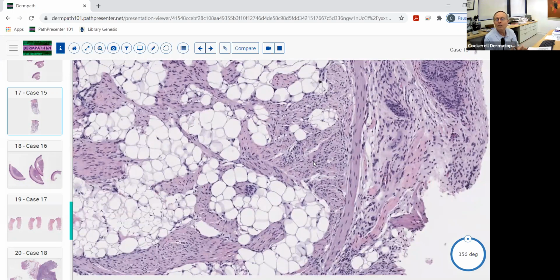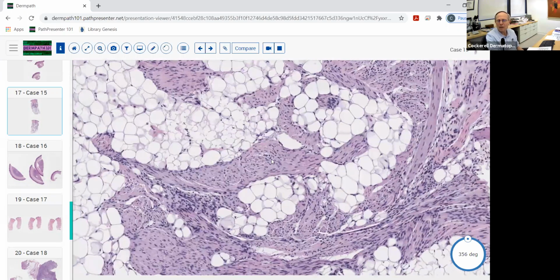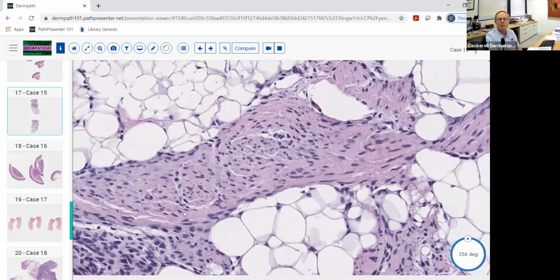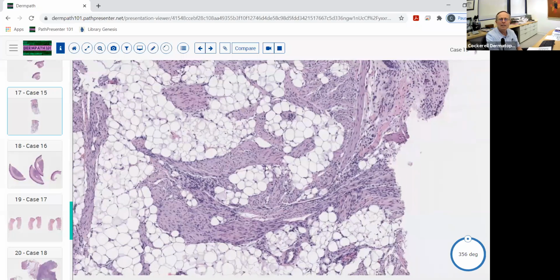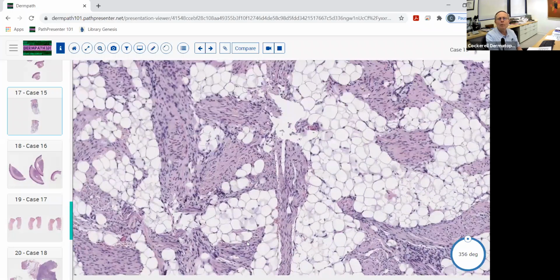fibrous hamartoma of infancy. These little almost whorls of little fibroblasts. They often have a slightly mucinous stroma to them in my experience. It can give you this eosinophilic collagen as well. Sometimes though you get a little basophilia like you see here with a little bit of mucin, and there may be a few inflammatory cells associated with it. But when you see these small aggregations of individual spindle-shaped cells with collagen, down in the subcutaneous fat, think of fibrous hamartoma of infancy.